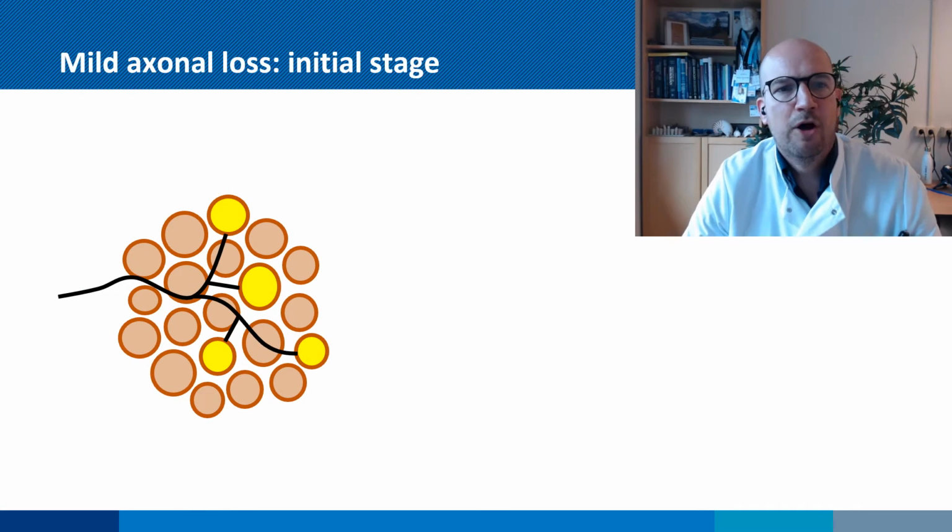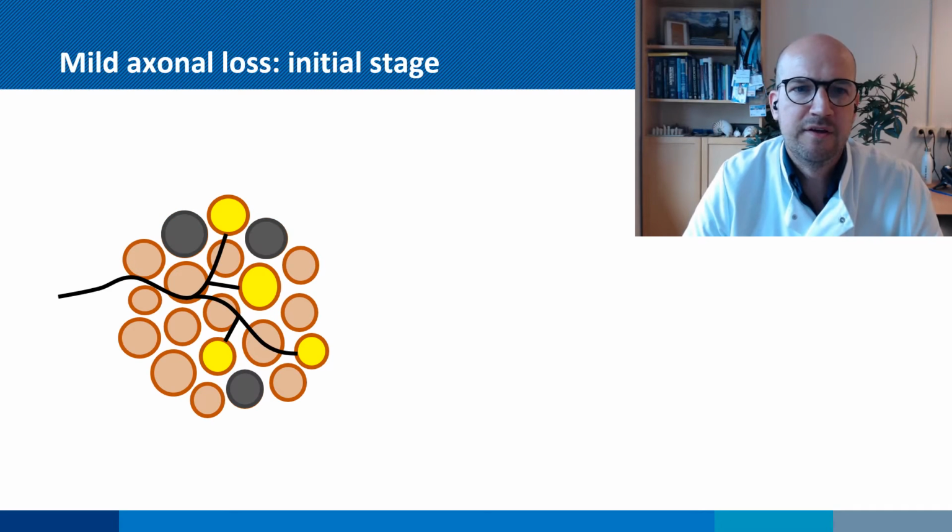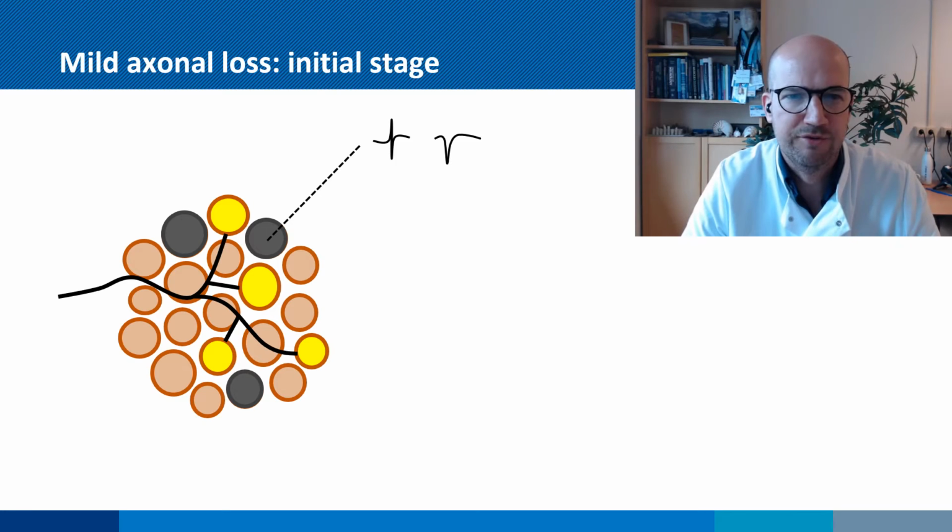In patients with a partial loss of motor neurons, for instance with polyneuropathy or partial nerve injuries, the first thing that will happen is that the loss of a particular motor neuron will lead to some muscle fibers being denervated. After about 2 weeks, these fibers will start producing spontaneous electrical activity. This low amplitude activity appears on the screen as fibrillation potentials and positive sharp waves. As a metaphor, think of it as small children who have lost their mother. They start crying out for help.